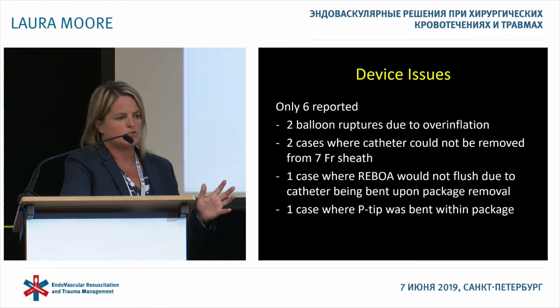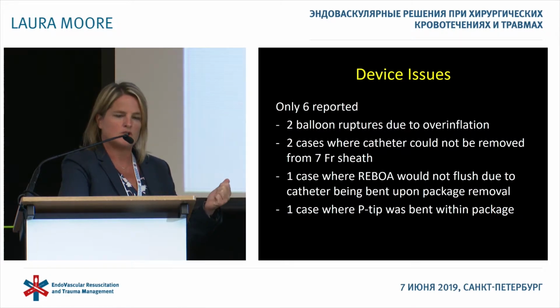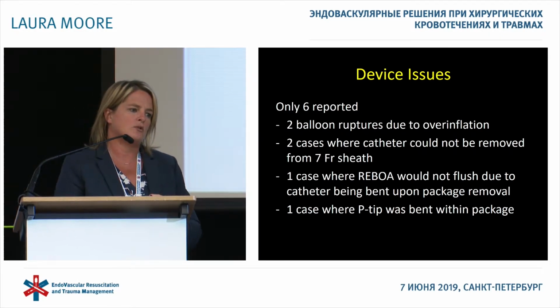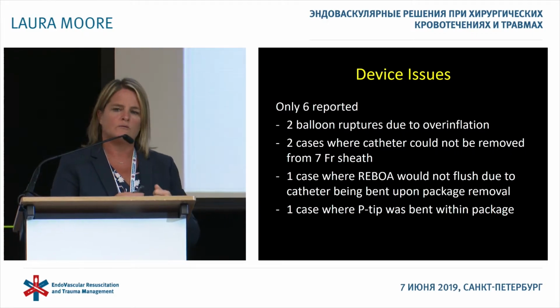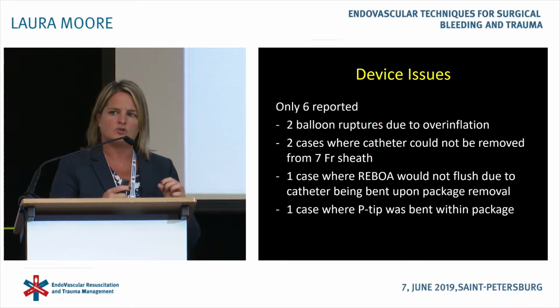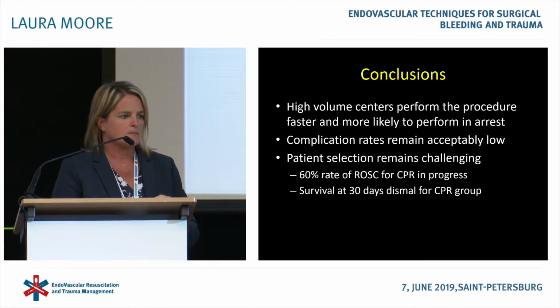Minimal device issues. We had a couple of balloons that ruptured because the practitioners put in more than 24 cc's, and that will cause the balloon to rupture. We had 2 cases where the catheter couldn't be removed because the balloon wouldn't fully deflate, and it required a cut down to pull those balloons out. And then a couple of issues with the catheter not being flushed or coming out of the packaging bent.